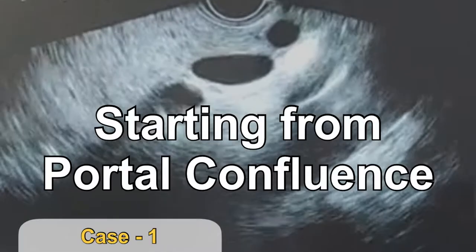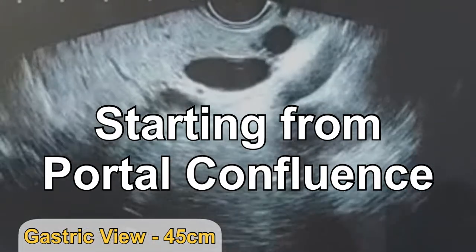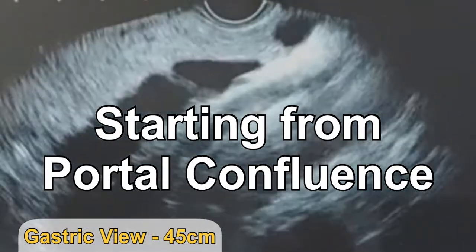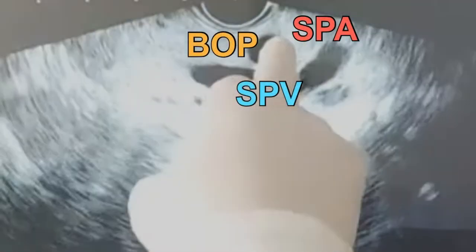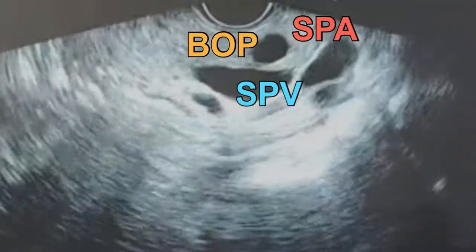I am now in the region of the gastric body, about 45 centimeters from the dental arch. This is the pancreatic body, splenic vessels, splenic arteries, and splenic veins.